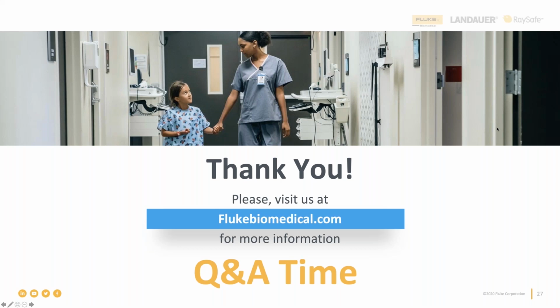So for me, I feel like a good medical device quality assurance program is always key for any hospital. If we think about what we're trying to do here, we're trying to ensure patient safety and operator safety. So with that, it's always electrical safety and a functional test.